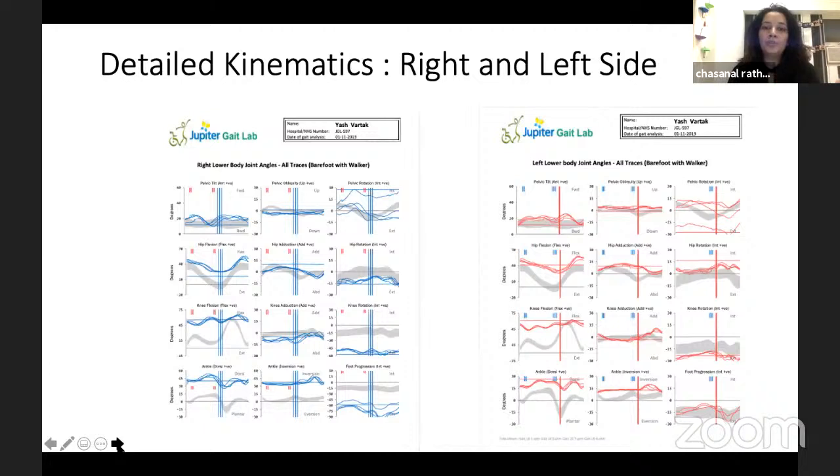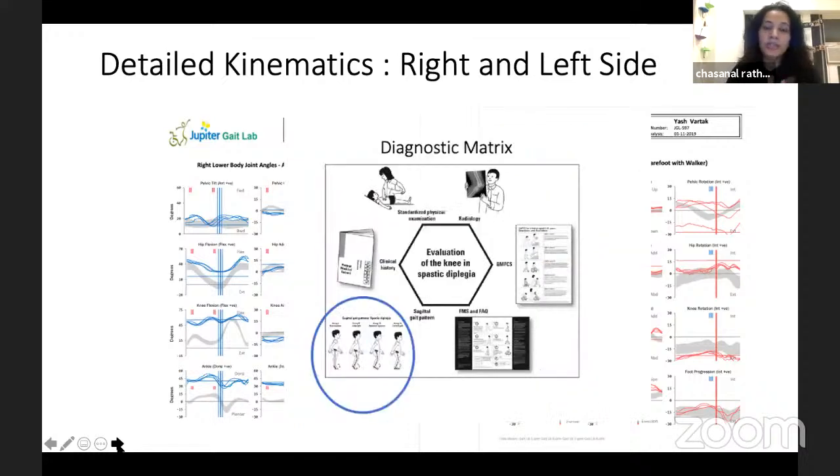And when we talk about gait analysis, just like Sir went through these graphs with you, I would like to bring up again, like Sir said, that the graph doesn't come with a report. It is up to us to interpret these reports. And just looking at the reports does not give us a solution. It has to be used as supplementary data with the entire diagnostic matrix.